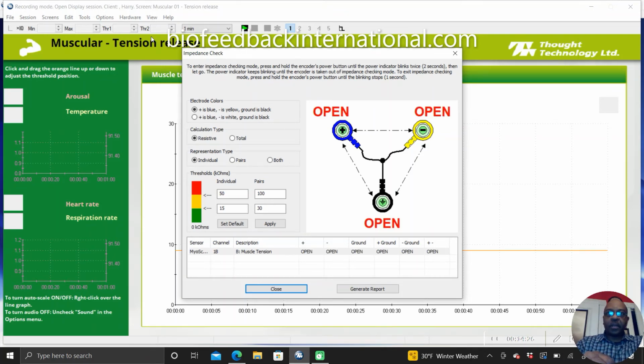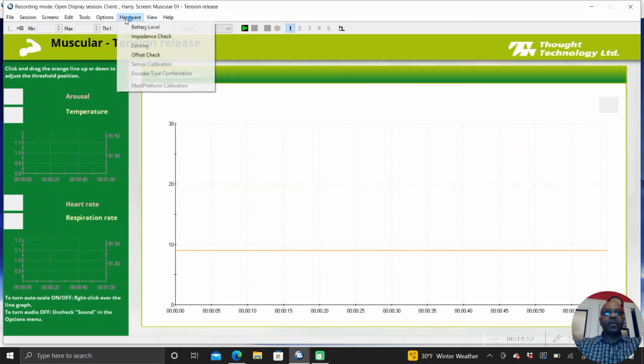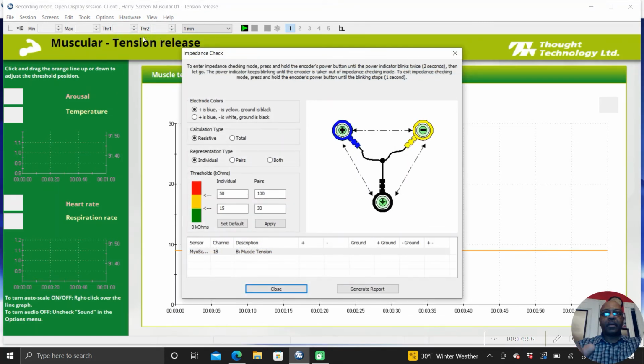Nope, it's still showing open. Very interesting. Let me just try one more thing. Take this out of impedance test mode and then put it back in impedance test mode. No difference. Still open. So this is telling me that the impedance that I'm getting with this setup is much worse than the other. Even when I take the sensor off, it's like I didn't do anything.